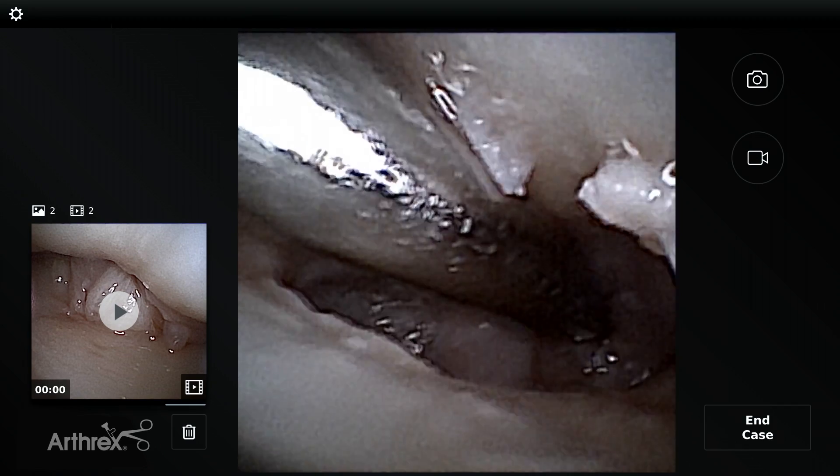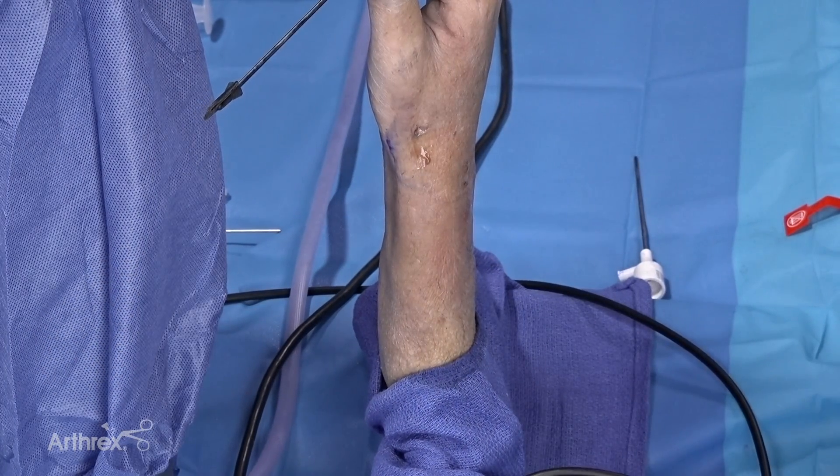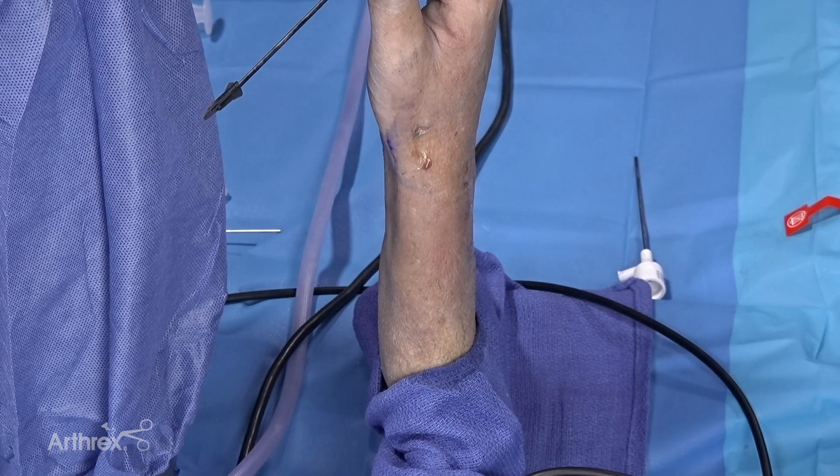This will allow us, for example, to do an arthroscopic trapeziectomy and a mini tightrope suspension arthroplasty should this be clinically indicated. Today we've done arthroscopy on the trapezometacarpal joint — arguably one of the hardest joints to do arthroscopy in, along with the DRUJ. The nanoscope demonstrated its ability to safely enter the joint without injuring articular cartilage, with a 120-degree field of view and an unparalleled view. Therapeutically, using the small joint shaver system, we're able to perform arthroscopic synovectomy, debridement, arthroscopic wafer procedure — the choices are endless.